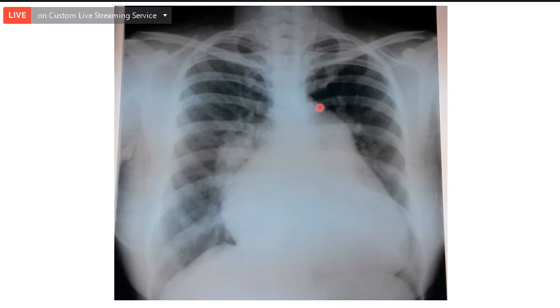So, what is this? Aortic knuckle. Why is it dilated? Normal? What do you think? Normal, sir. It's normal looking. Yes, it's normal. Okay, very good. Then the main pulmonary artery is enlarged. Pulmonary bay area is enlarged. Pulmonary artery segment is dilated.